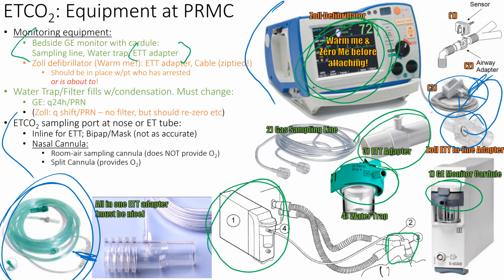And then you hook it up. If you try to zero it after attaching the patient, it's like weighing a patient, like zeroing a scale with the patient in the bed, right? So you don't want to do that. You want to fire it up, attach your adapter, zero it, and then you can attach it.